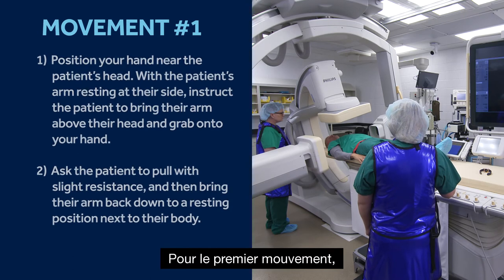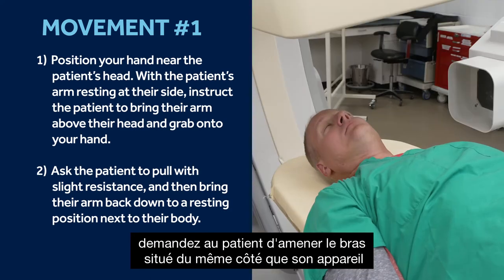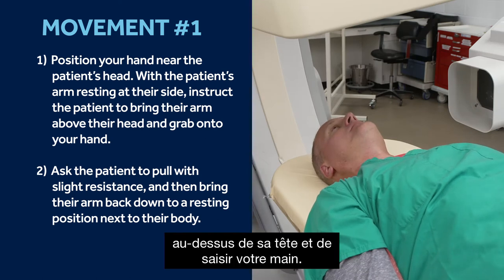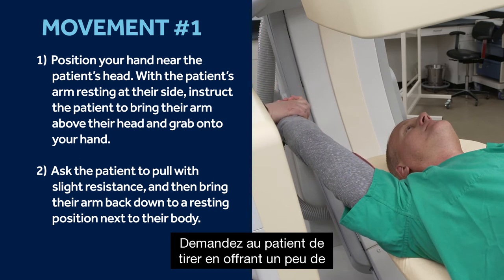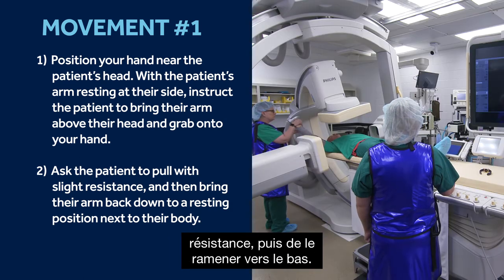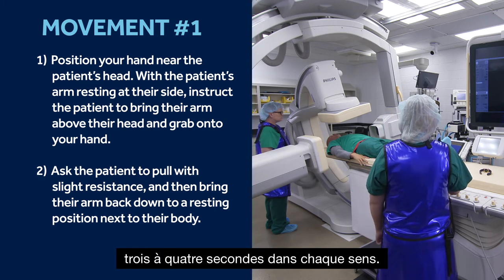For the first movement, with the patient's arm resting at their side, instruct the patient to bring their device-side arm above their head and grab onto your hand. Ask the patient to pull with a little resistance and then bring it back down. This movement should take about three to four seconds each way.